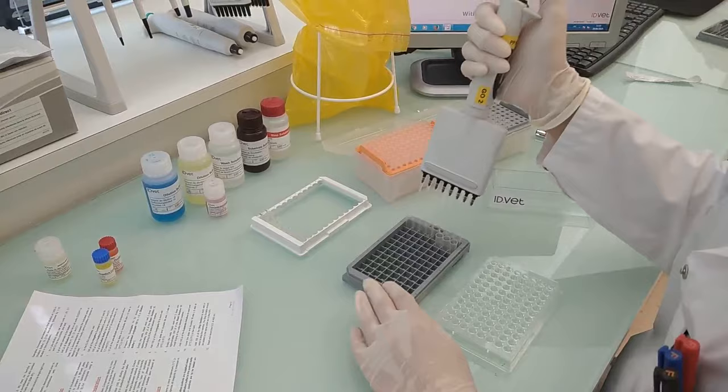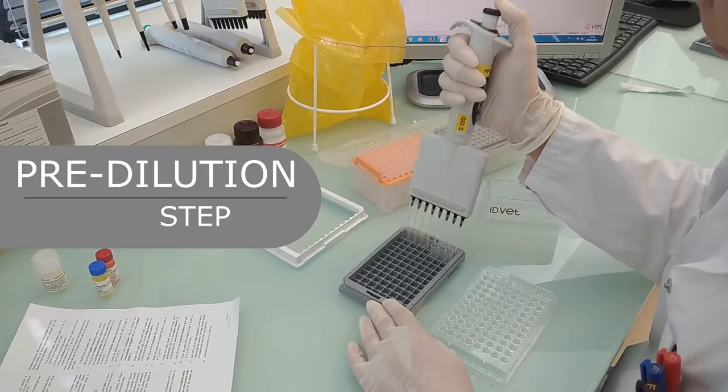Predilution step: In a predilution plate, add 5 microliters of each sample to be tested. Set aside wells A1, B1, C1, and D1 for the positive and negative controls, and E1 for an optional internal reference material.